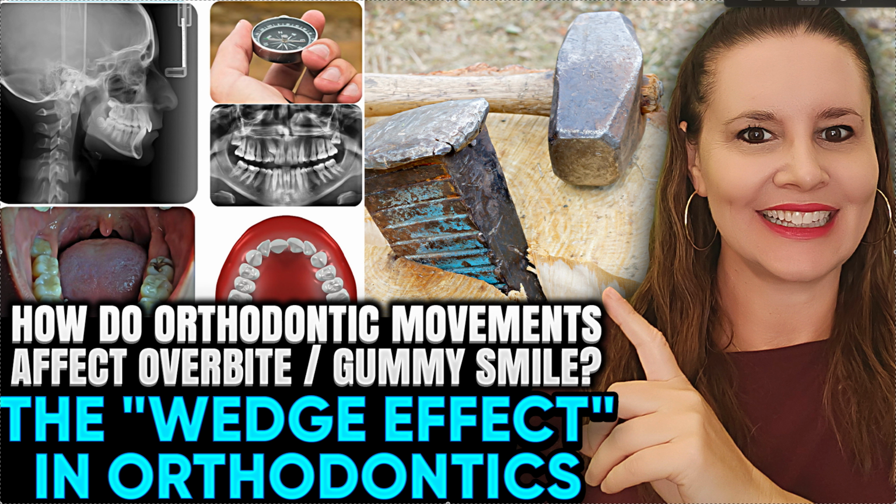when you change AP. Okay, so when you change AP, whether you extract premolars or you do a bunch of IPR, you do sequential distalization, or you procline, that changes AP, right? If you don't understand what I'm saying, then you need to go backwards and either take my Straightwire course or my Phase 1 course, probably my Straightwire course. We talk more about the basic physics and the different ways we move teeth out, vertical, transverse, AP, all that kind of stuff, sagittal. So you should understand that.